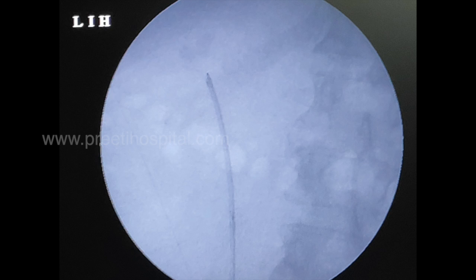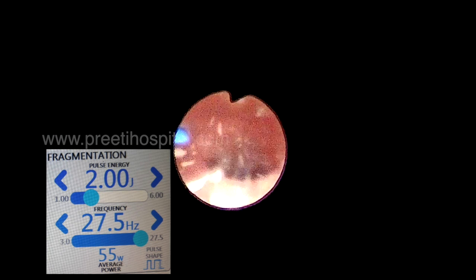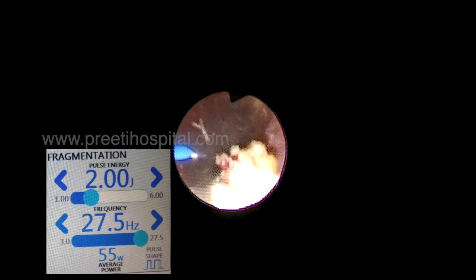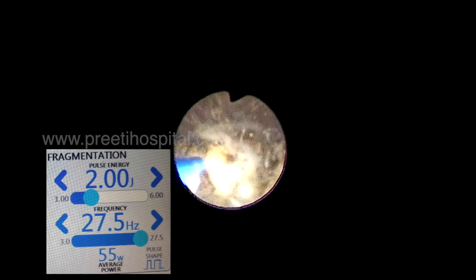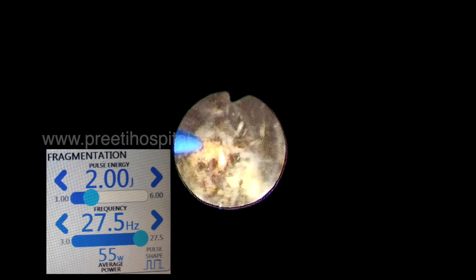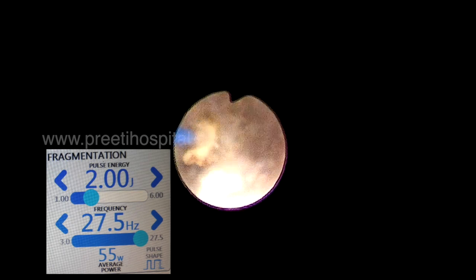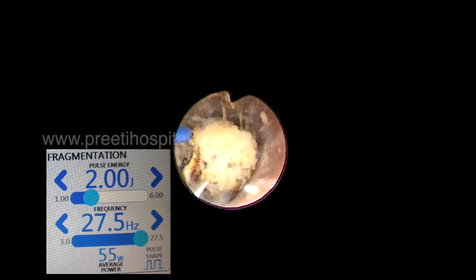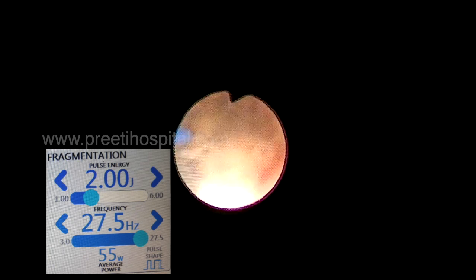Then the scope is straight, so chances of scope damage are less. Now we deliberately use fragmentation mode with 2 Joules and 27 Hertz. This setting is not available in 30-watt systems. We usually say stone work can be easily done with 30 watts — absolutely correct — but for large stones it takes time.